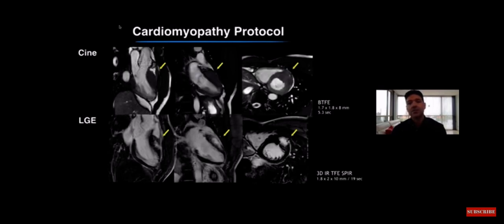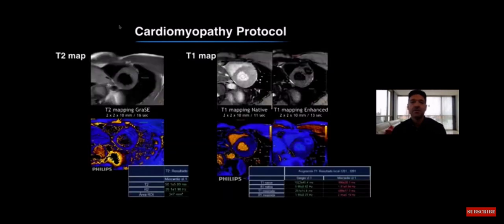So CMR is a really central imaging modality to risk-stratify cardiomyopathies. Also in this case, the T1 map firstly helps us to discard other possible differential diagnoses mimicking hypertrophic cardiomyopathy, for example amyloidosis or Fabry disease, which are pathologies with completely different treatment and prognosis. And T2 confirms no presence of myocardial edema or myocardial inflammation. So definitely the multiparametric power of CMR allows us to identify in the same study many aspects of complex pathologies.